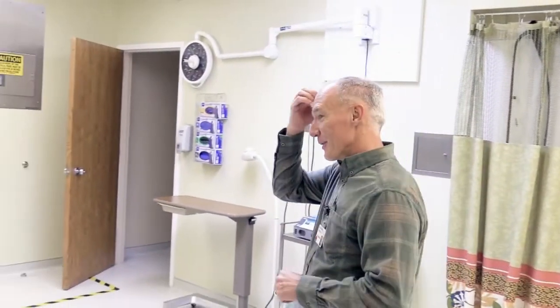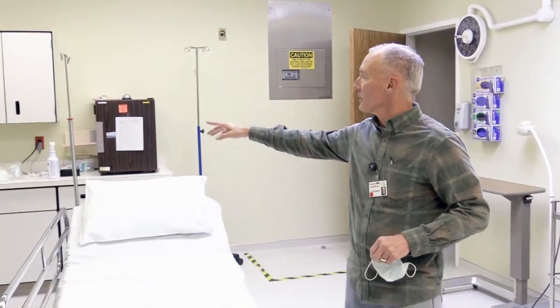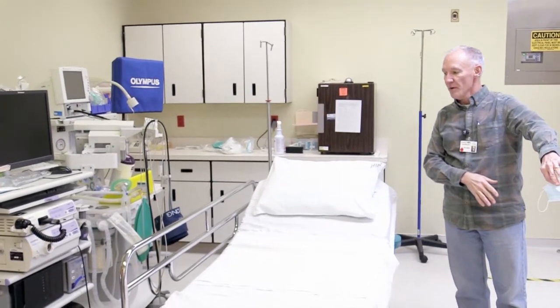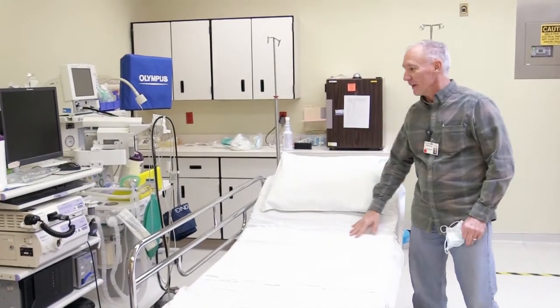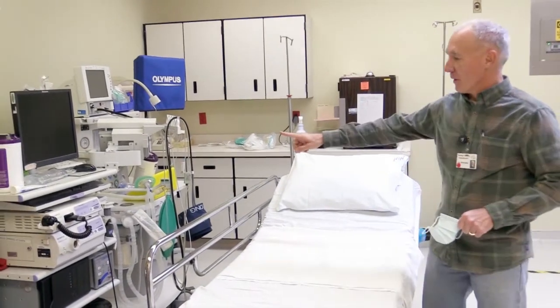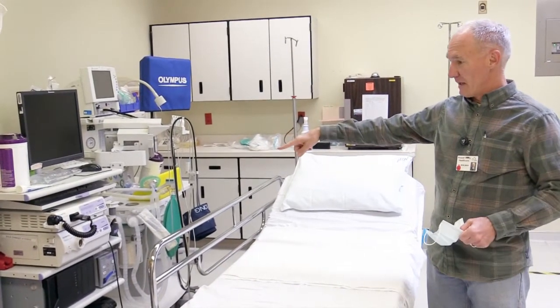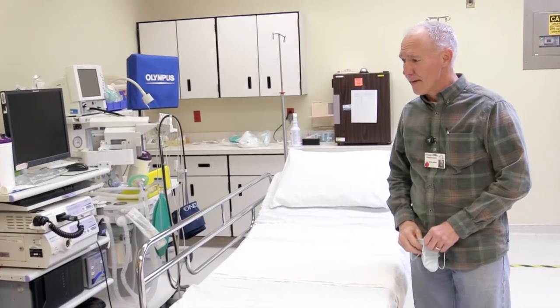So this is the endoscopy suite, and the machine that the scope's hooked up to is there, and then there's a TV screen over here that will normally go right here. And the person getting the colonoscopy will be here, and then there'll be a nurse here, and normally an anesthesia provider here, and then whoever's doing the endoscopy, me, Christensen, or Reeb, will be standing there, and then there'll be an assistant helping us too. So that's who all's in the room.